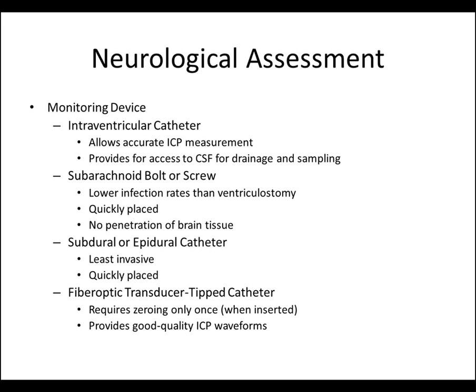However, some of the disadvantages to this intraventricular catheter are that it's a potential site for infection, and it is the most invasive method for monitoring ICP.